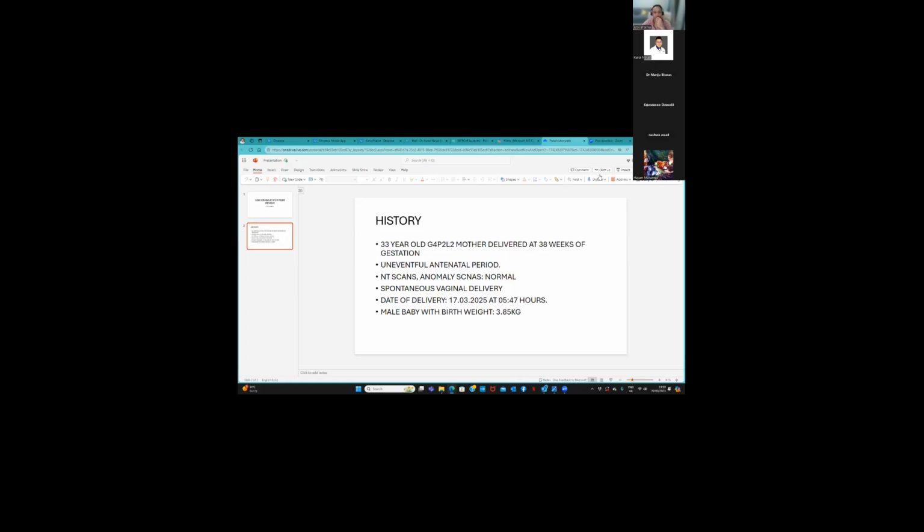Okay. So what I have done is I have tried to do a scan of a term cranial scan for a term newborn. Okay.